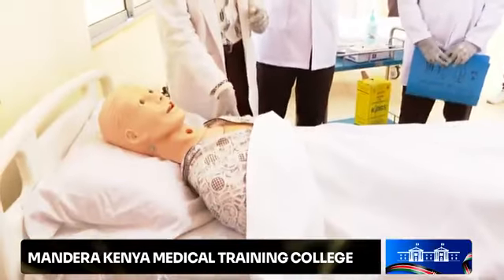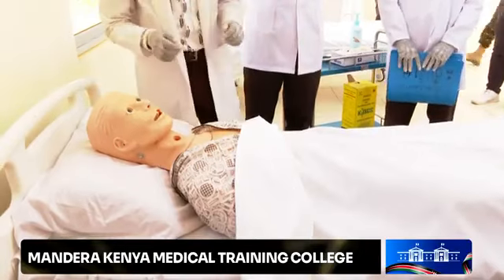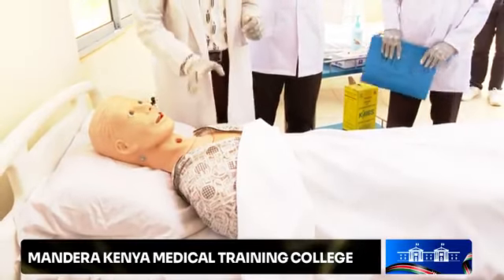IV, through the intravenous. We have got oral drug administration. For the purpose of this demonstration, we're going to do IM, intramuscular drug administration. The site of drug administration for IM, we have got three parts: one at the deltoid region, at the thigh, and then at the back, the gluteal one.